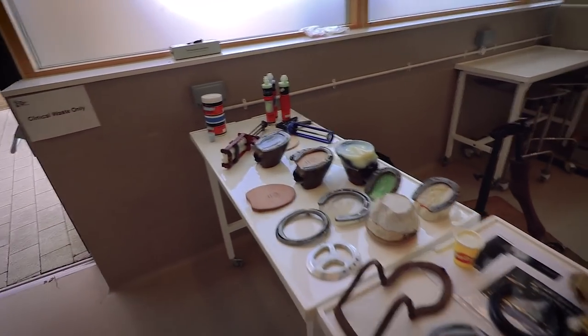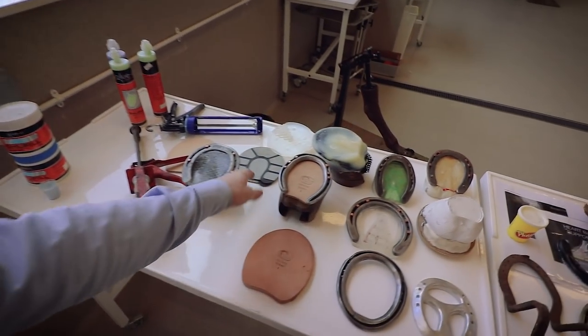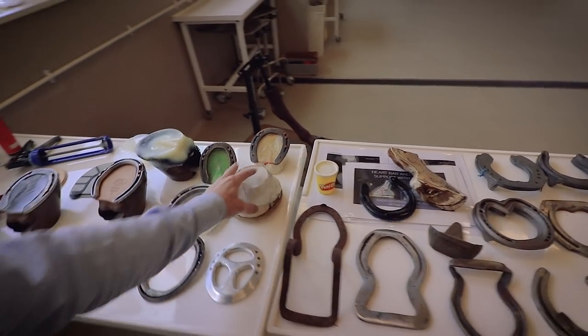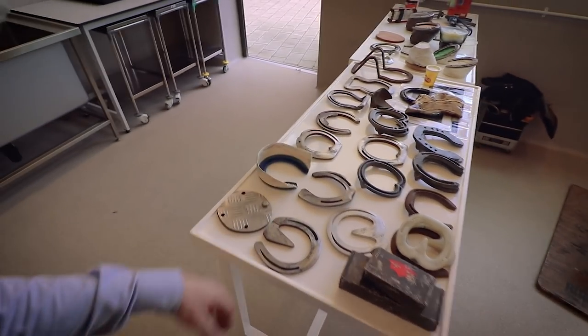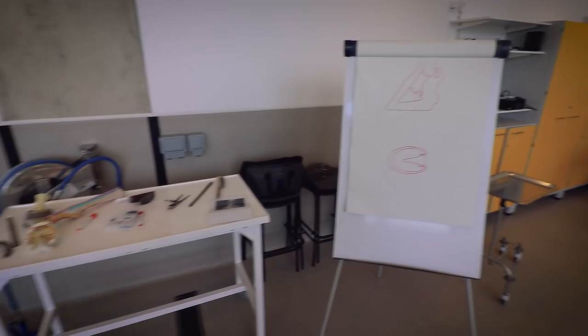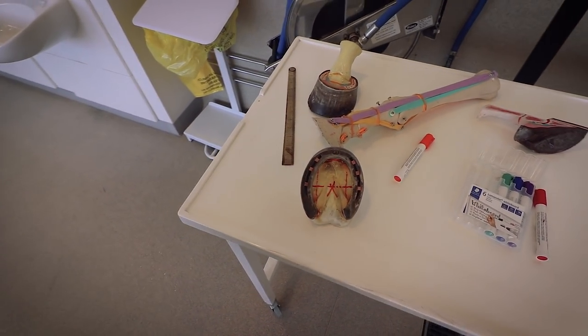So we've got a couple of examples of some of the modern materials we use, whether it's the silpacks, the different types of pads. We've got former hoof here, leather pads, clogs, and then a range of different bar shoes. A lot of them have been handmade. I've got a station on foot mapping, understanding hoof balance, and how we actually work out shoe placement.